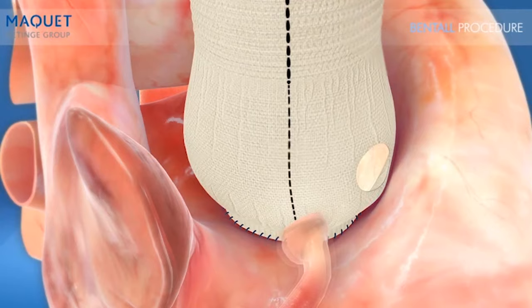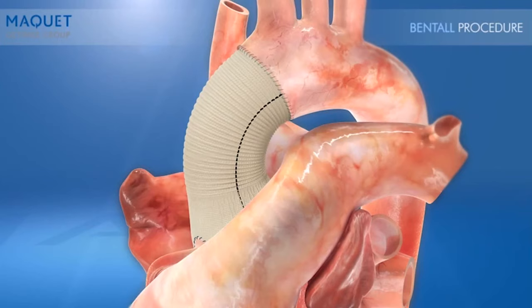Finally, the coronary buttons are re-implanted and the distal end of the CardioRoute graft is sutured to the native ascending aorta.